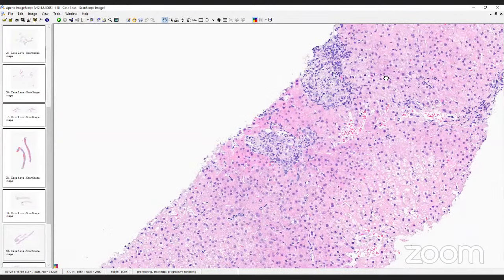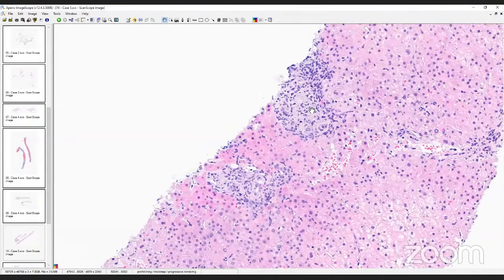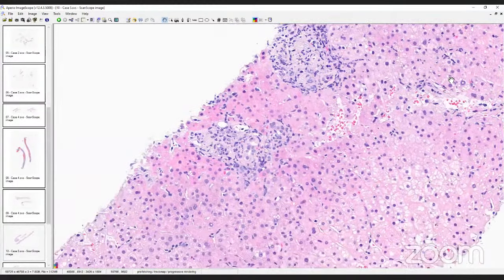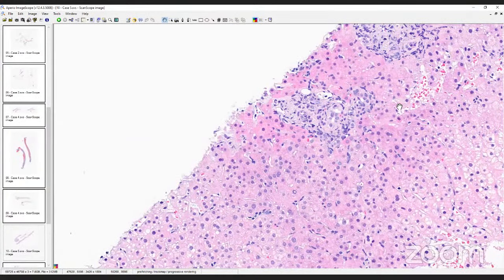and I go from one end to the other, what we see here is a portal tract where the bile duct doesn't look terribly happy. And there's something here too. And this seems to have a very thick basement membrane. And then there is a mild inflammation, and I suspect a little bit of a ductular reaction as well, meaning that there are proliferating bile ductules as well as inflammatory cells, and then these damaged bile ducts with a thick basement membrane.